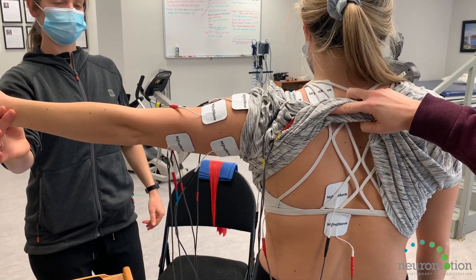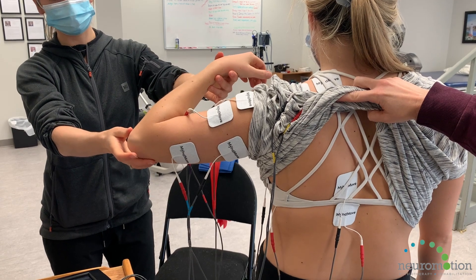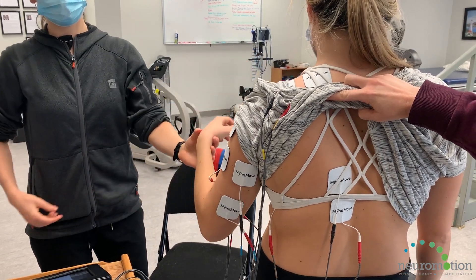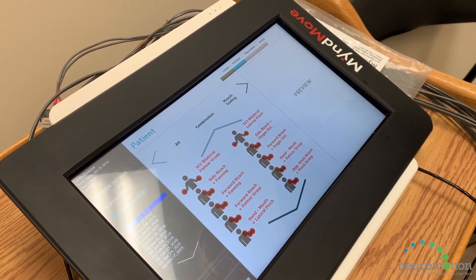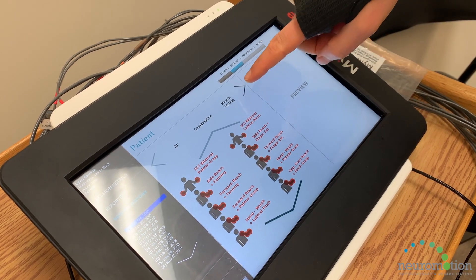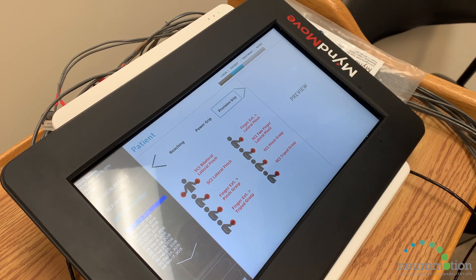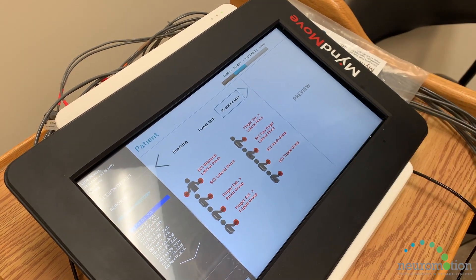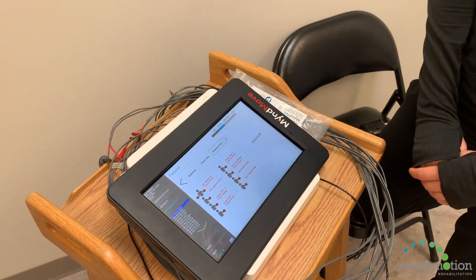You could do a side reach or forward reach, and there are combination protocols where you do the reach along with an opening or grasping movement. There's also a hand-to-mouth protocol to facilitate the functional movement of eating, combined with the grip. Scrolling through, you can also get into more precision grip work — such as a tripod grasp — if the goal is writing, depending on what the client's goals are.